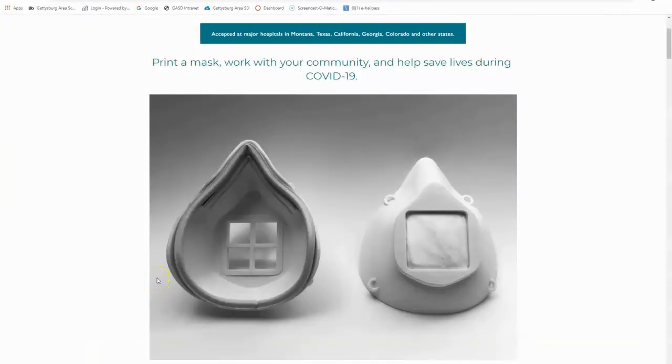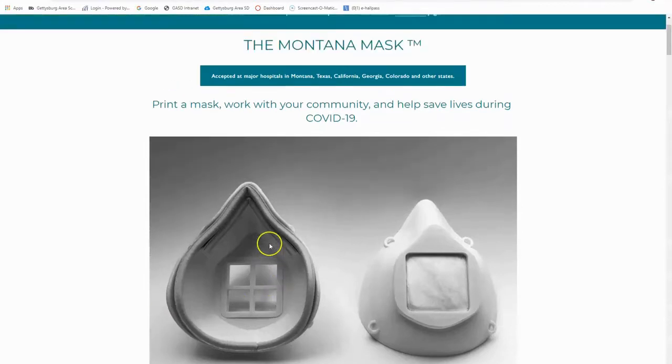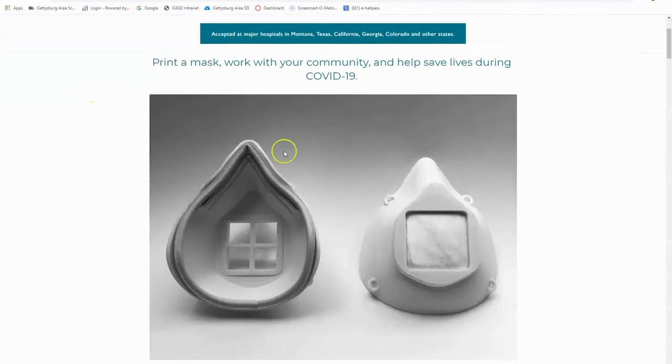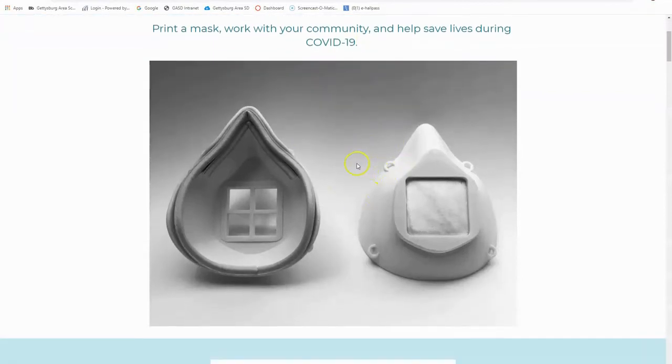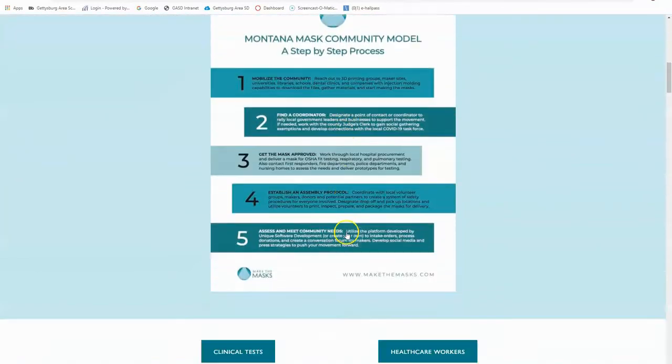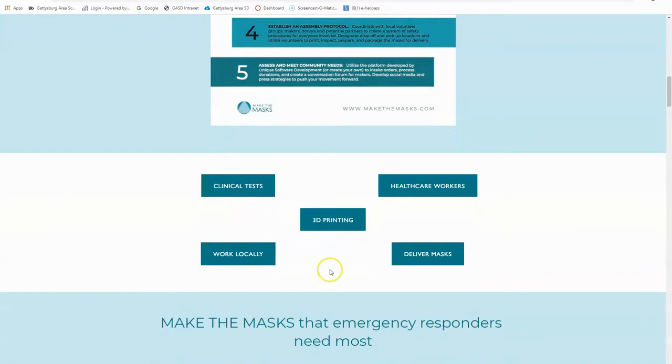Everybody, in this video, we're going to walk you through how to set up the 3D printing process for the Montana mask. Right now I'm on makethemask.com, and as you can see, the Montana mask website has an image of the mask here, inside and outside, and it's one long website with links on the pages.